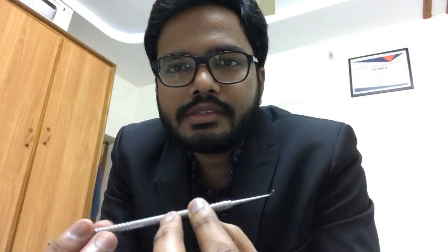Okay, great. So it's a parallelogram condenser. Okay, good. So I think it's pretty clear now, right? Yeah, parallelogram condenser. Okay, fine. Yeah, comparatively easy. And yeah, this is also a condenser. Now, identify this instrument.